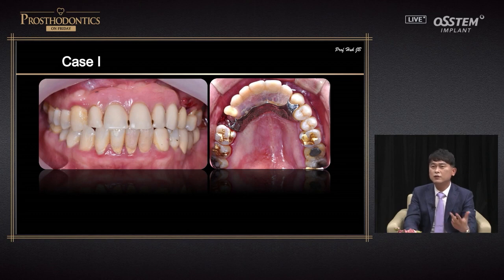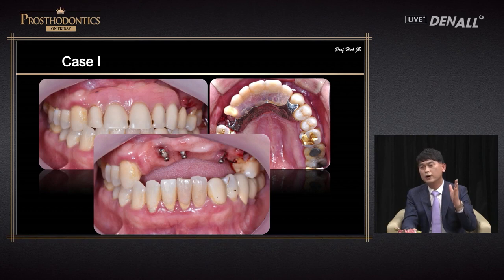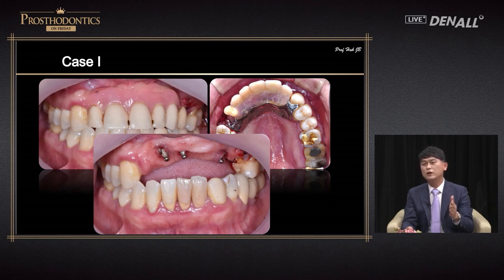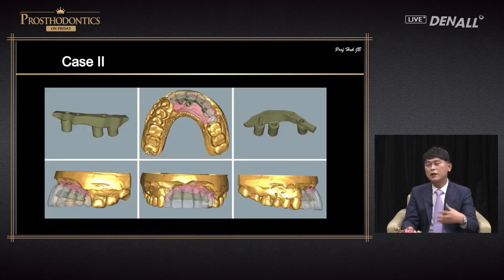3 years ago, the patient received the denture. Hard to believe. The abutments are all broken and clasped as well. And implants are placed like this. I'm not blaming the dentist for placing them. Focusing on the available bone, it could have been placed better. It's hard to remove bone vertically and horizontally in this patient. The problem is 3 implants were placed, O-rings and clasps were used, destroying abutments, and because of the movement, occlusal points could not be provided.